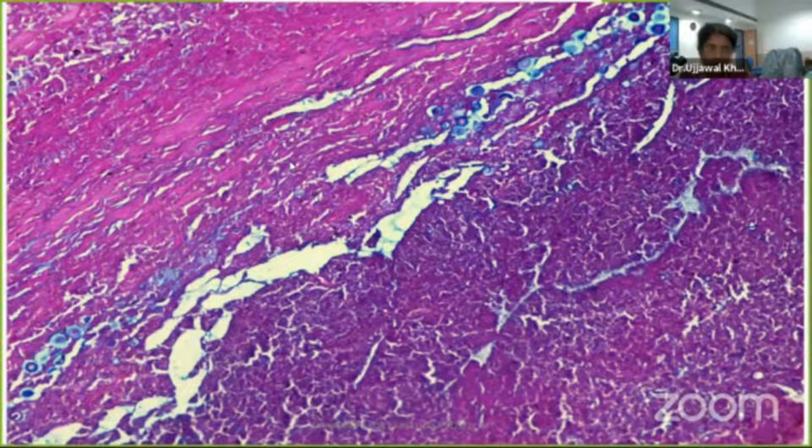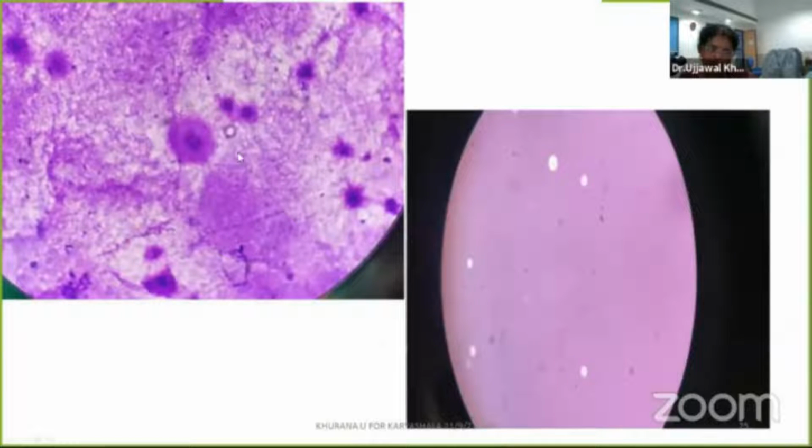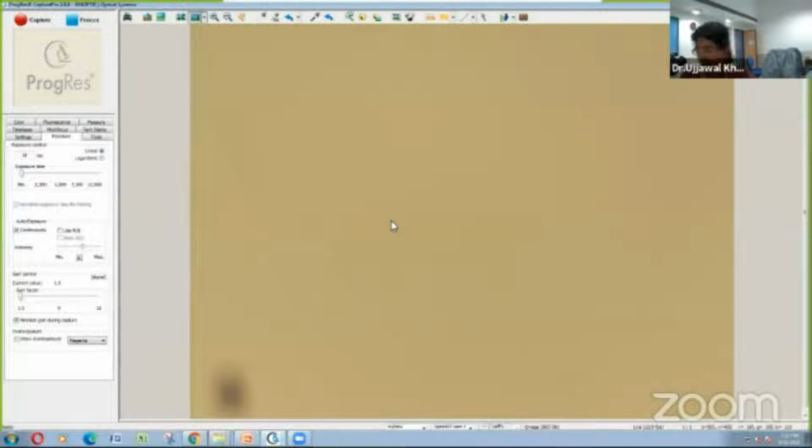So the same patient then developed a typical soap bubble appearance, very nicely seen. These yeasts are slightly varying in size, and some of them are showing crescentic shapes also, and the capsular thickness also varies. The capsule has some reflection of the virulence, which I had also heard Dr. Khurana say in one of the talks. And now I'll show you the special stain of the patient.